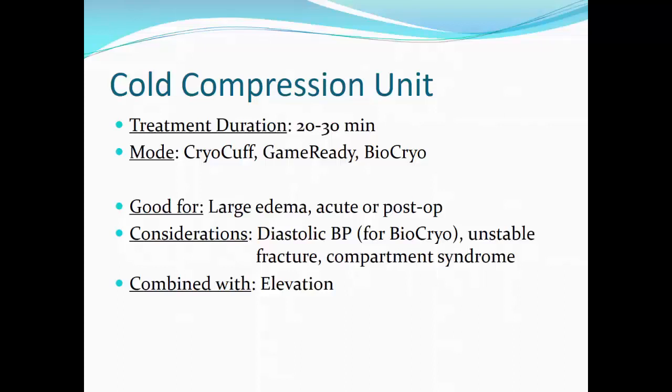on the market. Cold compression units are good for treating large areas of edema, especially those associated with acute injury or post-operatively. Considerations for the use of cold compression units include taking the patient's blood pressure. The diastolic blood pressure must be evaluated for the BioCryo unit. We also need to be aware of unstable fractures and compartment syndrome, as any increase in pressure for these 2 injuries is contraindicated. Cold compression units are frequently combined with elevation to enhance the effects of treatment.